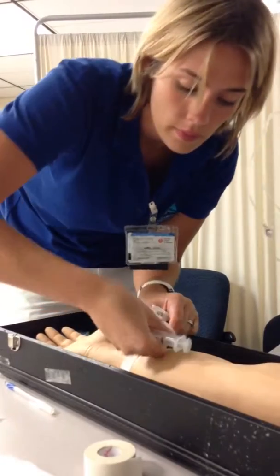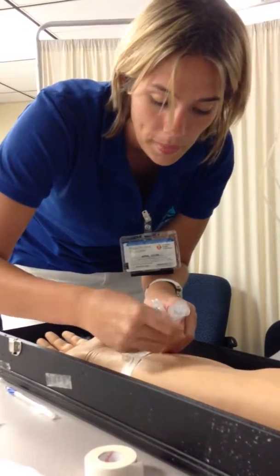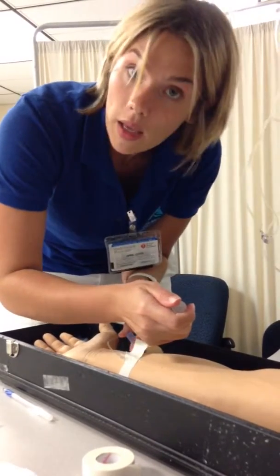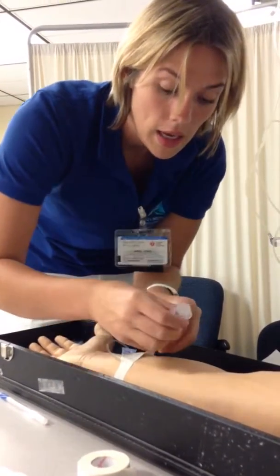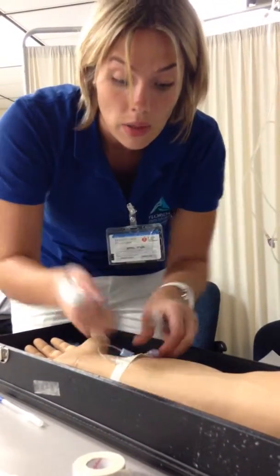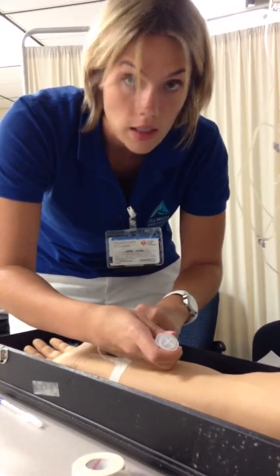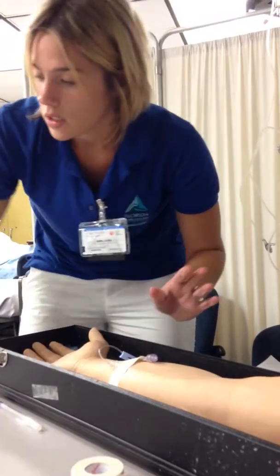Everything is fine with his IV. I'm going to wash my hands and glove up. I'm going to unclamp. 3 more ml. It flushes fine. My client has tolerated it well. Clamp it back. I would clamp it after I flush the last half ml. I would clamp it simultaneously. Clamp this off. Dispose of this.